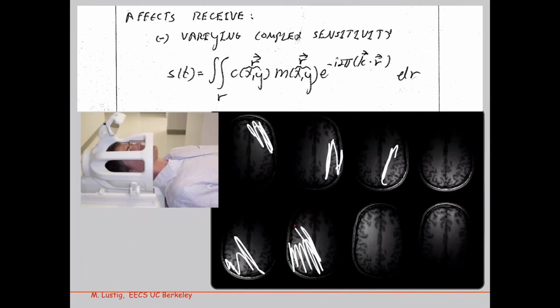This is called parallel imaging, and many methods have been developed to speed up acquisition, reducing the number of phase encodes so that you can image faster. It's a huge game changer. There isn't almost a single sequence in the clinic right now that doesn't use parallel imaging. The fact that you're imaging with multiple coils is almost transparent to you when you scan. It just turns on by itself, and you type a 2x acceleration button, and it speeds up by a factor of 2. So is a factor of 2 a big deal?